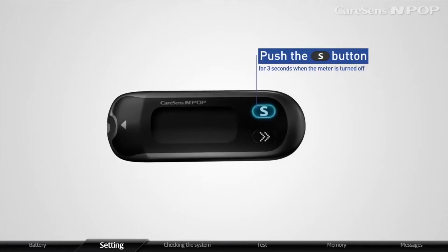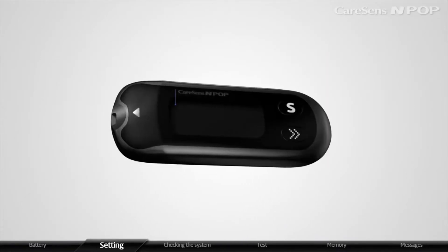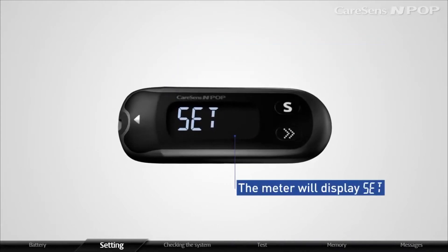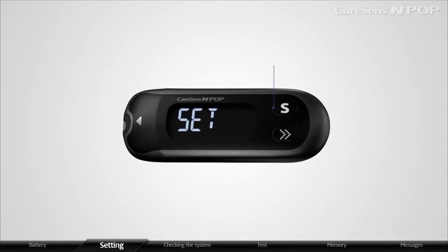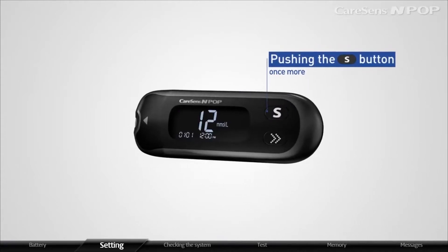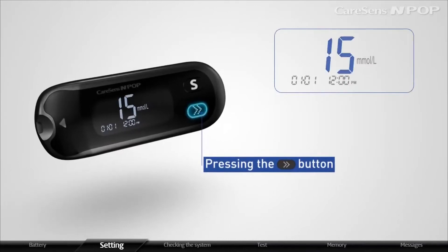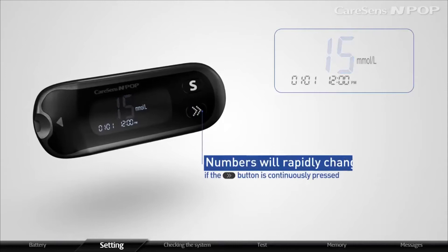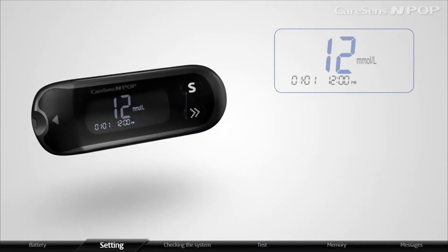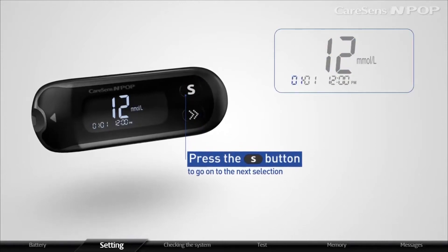Push the S button for 3 seconds when the meter is turned off. After all the features appear on the display for 1 second, the meter will display Set. The meter will display year settings by pushing the S button once more. Please set a correct year by pressing the arrow button. Numbers will rapidly change if the arrow button is continuously pressed. After setting the year, press the S button to go on to the next selection.